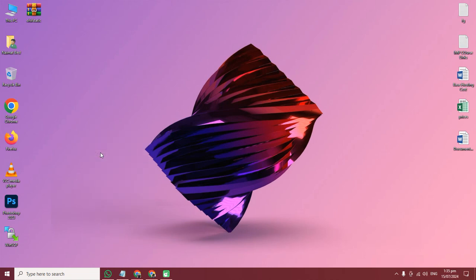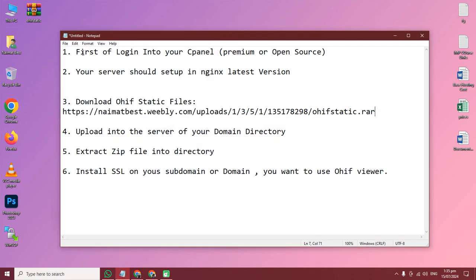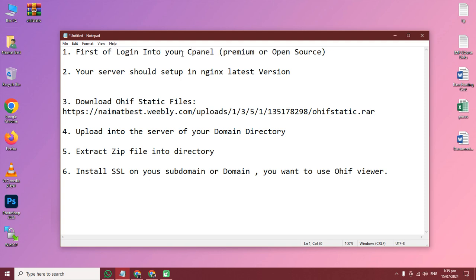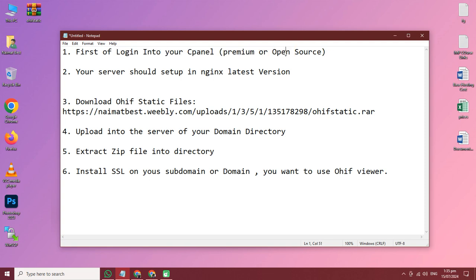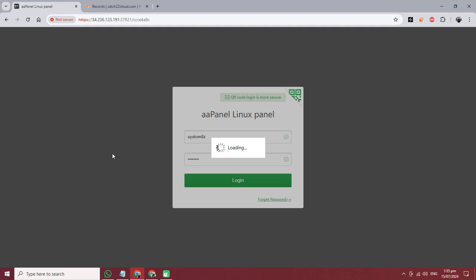Hi, good afternoon. In this video I will teach you how to install or deploy the static OHIF viewer into any control panel. First of all, you need to log into your control panel, premium or open source. I am using a free control panel, so I am logging in.